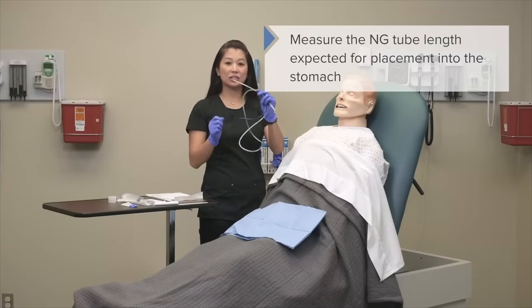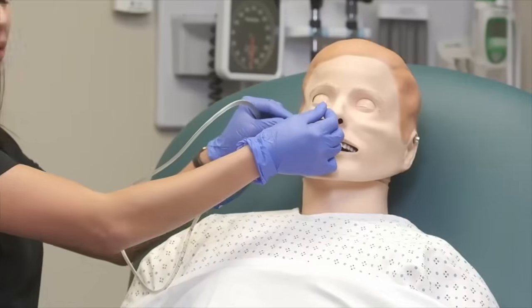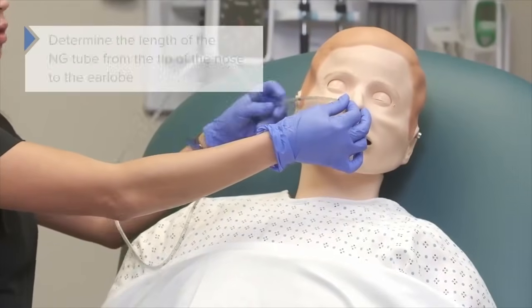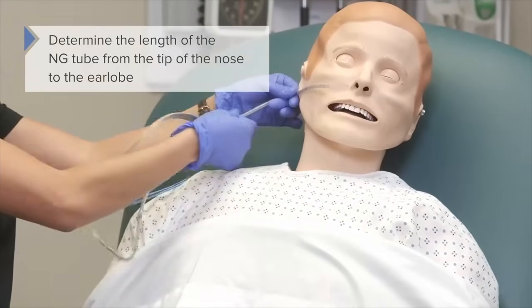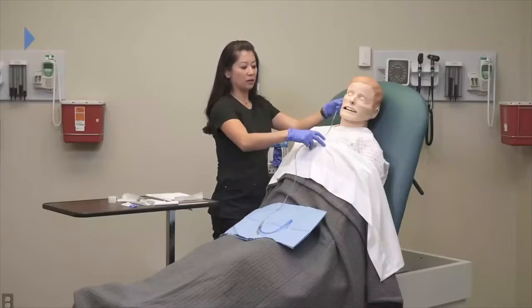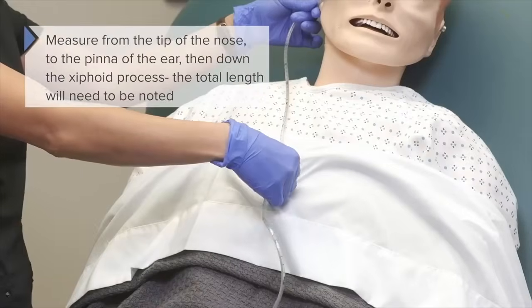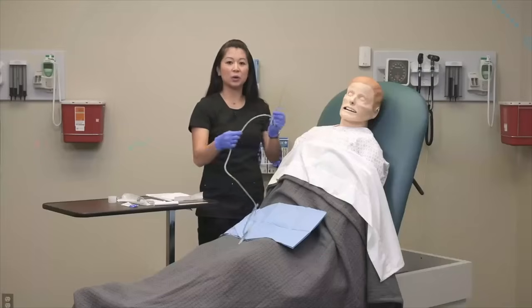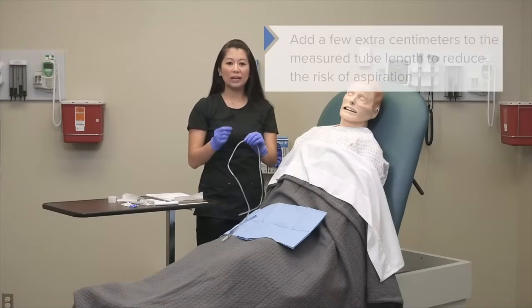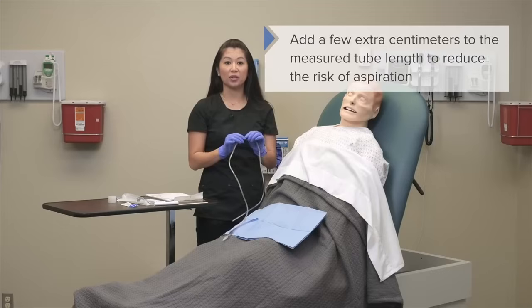So I'm going to take this distal tip here and take it to the tip of the patient's nose. So we're going to take it to the tip, then to the side of the earlobe, and then I'm going to take my measurement and go down and palpate where his xiphoid process is. And if you want to, it's always a good idea just to go a few centimeters over. The reason why I do this, like I spoke about earlier, is that it's always better to go a little farther down because that's much less risk for aspiration.